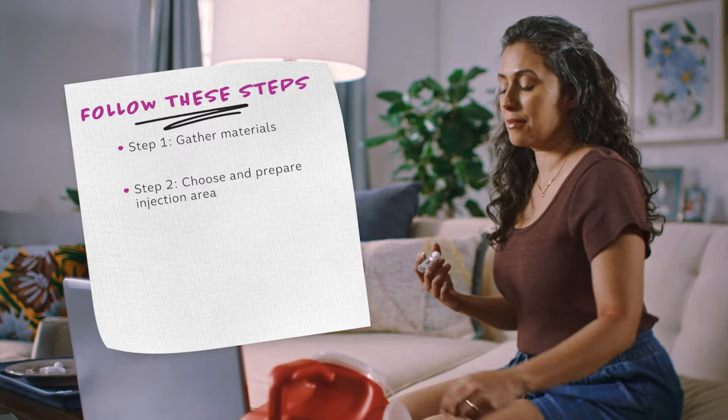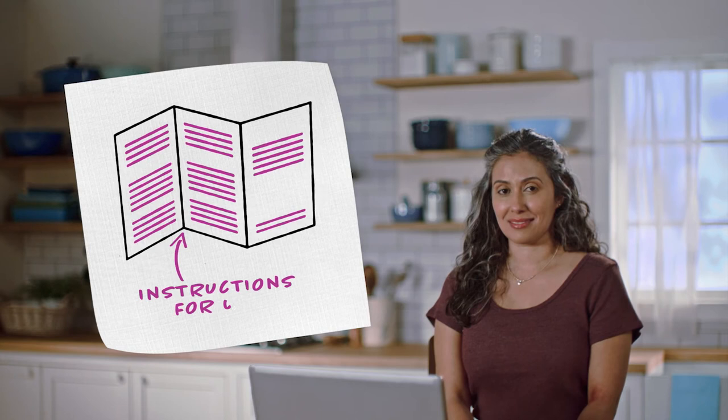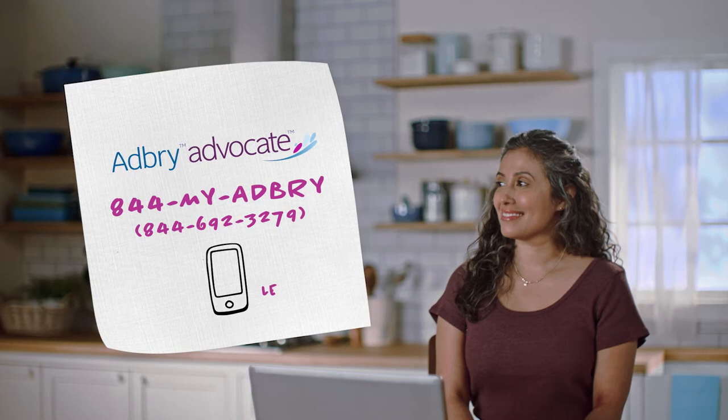She'll go over what materials you'll need, how to choose and prepare the injection area, how to self-inject, and how to dispose of used syringes. Before we keep going, it's important that you've carefully read the instructions for use that comes with your ADBRY carton. If you haven't yet, pause the video and take a look. We'll keep going once you're done. If you have any questions, you can always contact your healthcare professional or the ADBRY Advocate Patient Support Program at 844-MY-ADBRY. Let's get started.